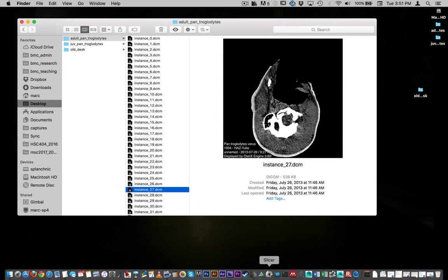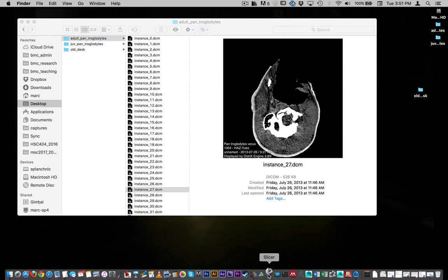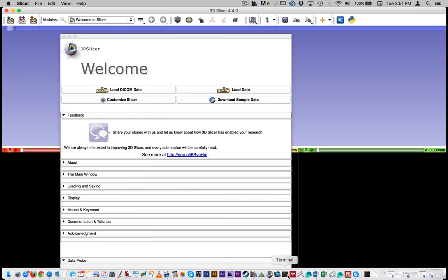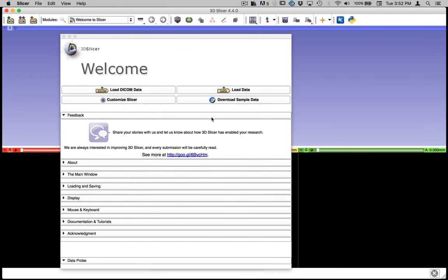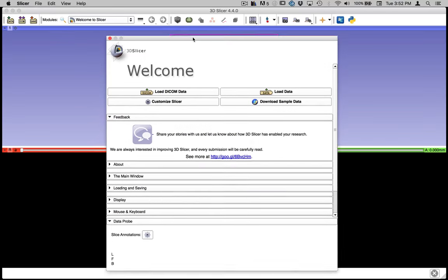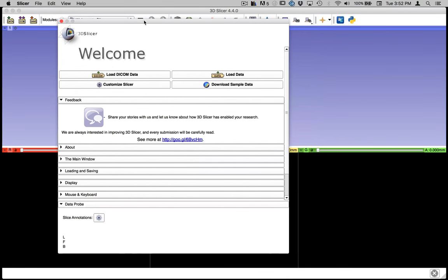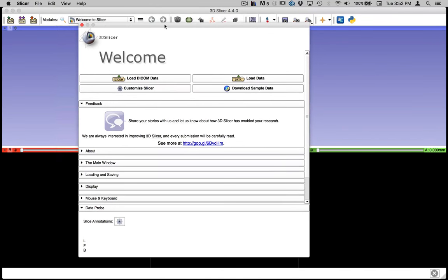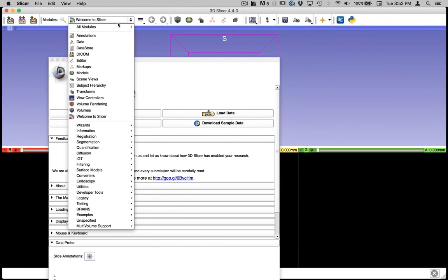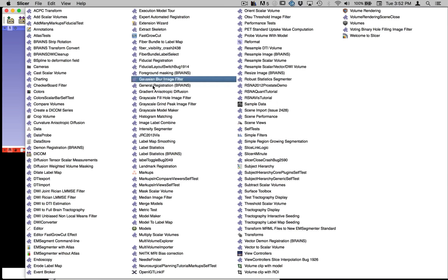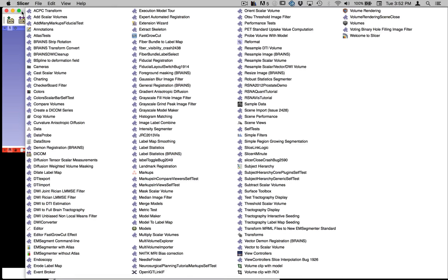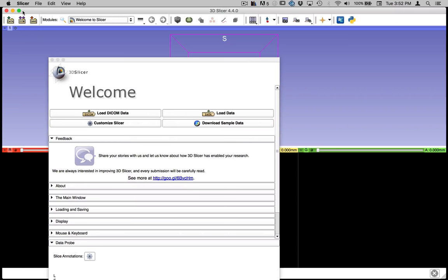So when you download it, you'll get an application like this. And I'll just launch slicer here so you can see how it opens up and I'll walk you through the interface a little bit. So slicer is a modular type of application in that it has an interface, but then you interact with it by loading different modules that do different things.